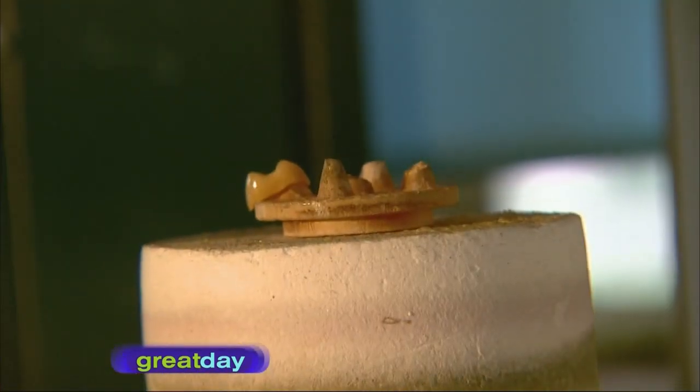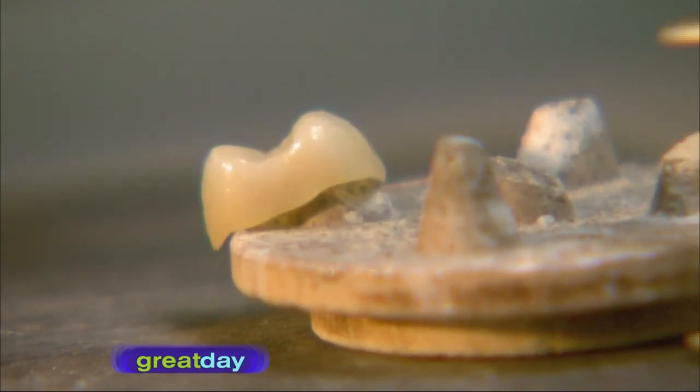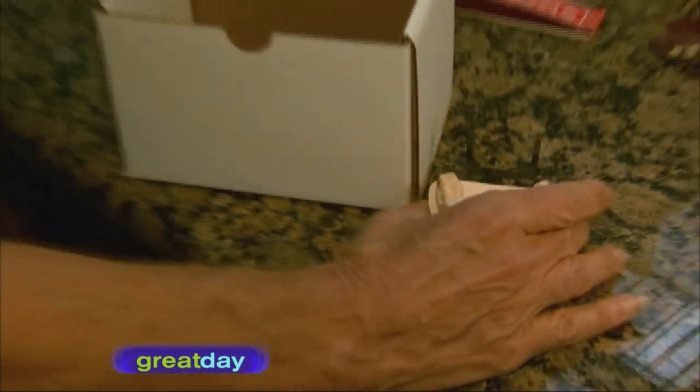Finally, the crown is put into a glazing oven to produce a shiny finish — and voilà, a crown is born. Remember, next time you have a crown made, someone somewhere has tailor-made it especially for you. And this is how crowns are born.